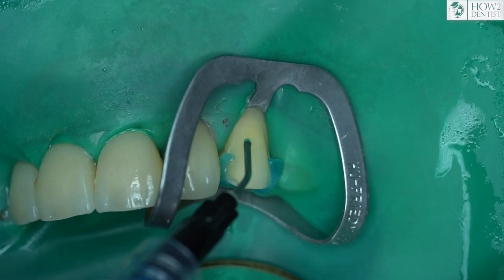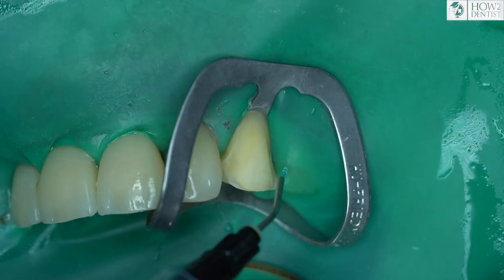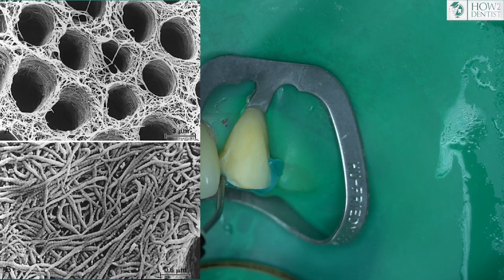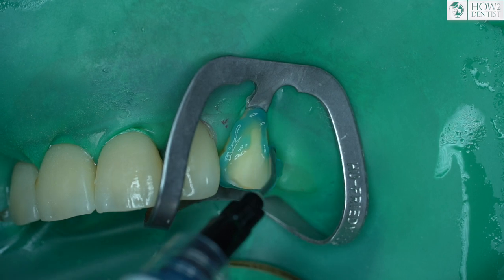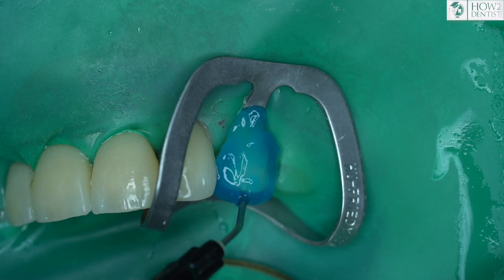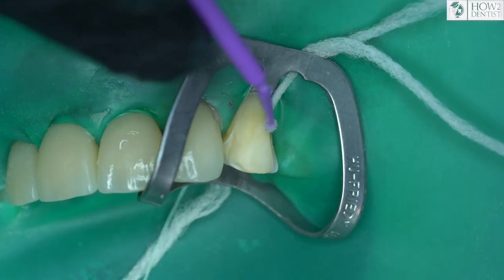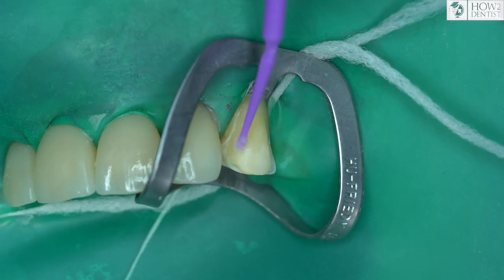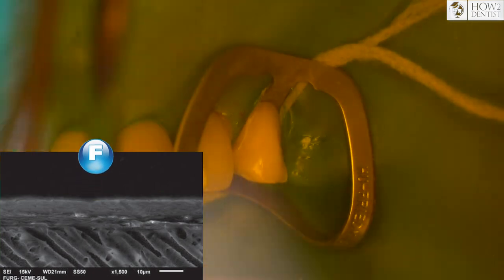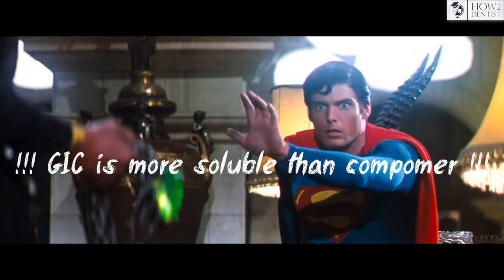For adhesion of GIC, it is not necessary to etch and dry the tooth tissue. On the contrary, it is important to maintain the humidity of the hard tissues. When cleaning a tooth with phosphoric acid, the intercollagen layer dissolves and voids are formed that GIC cannot fill, while the phosphate and calcium ions needed for adhesion are washed out. In the case of compomers, you can use adhesion from the composite matrix as in the above instructions, but then you need a multistage adhesive protocol, and the bond layer will block fluoride diffusion — meaning the benefit of GIC in the composition is lost. It will only weaken the composite and increase solubility.